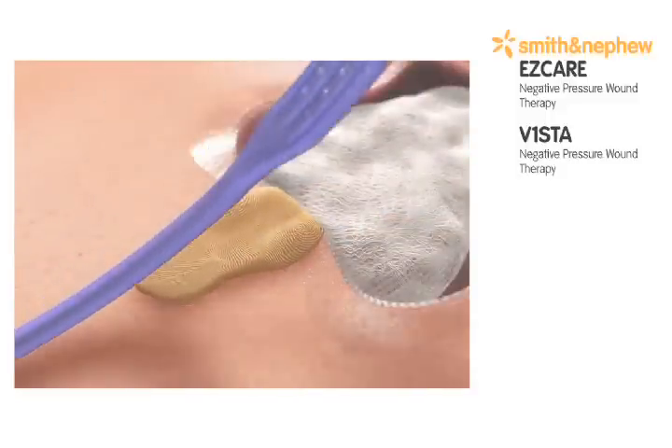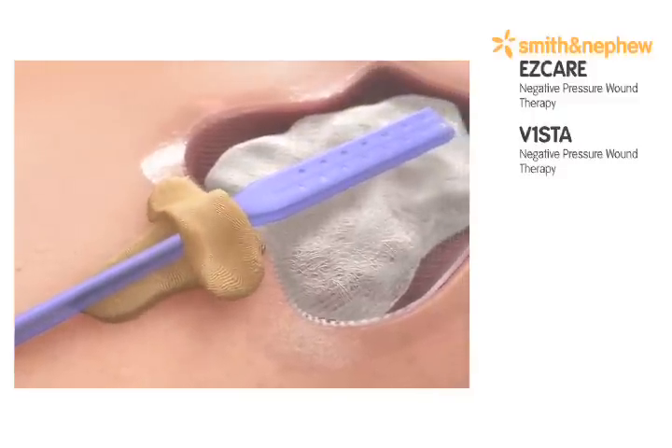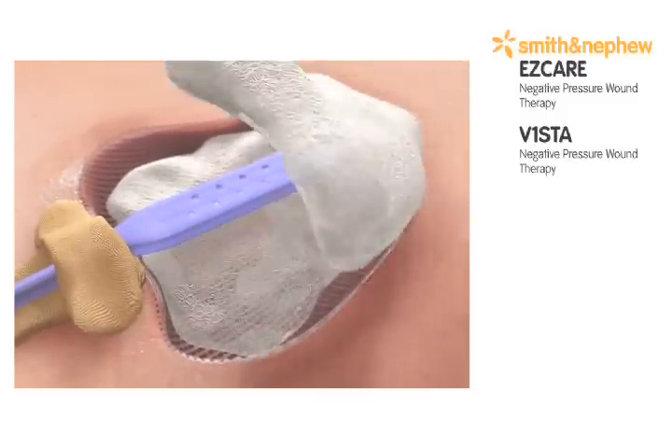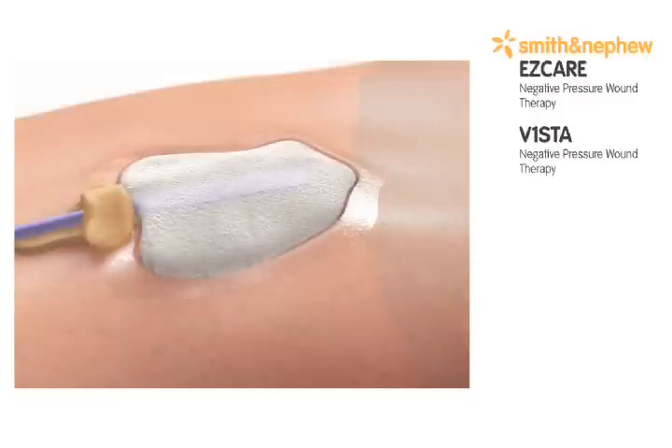Apply ostomy strip paste to the wound edge to secure the drain. Place the remainder of the paste over the top of the drain and pinch in place. Fill the wound bed with saline-moistened antimicrobial gauze, loosely filled to the surface of the wound. Avoid over-packing.